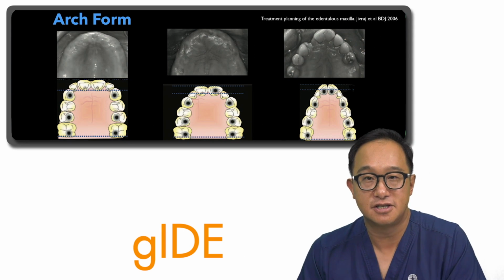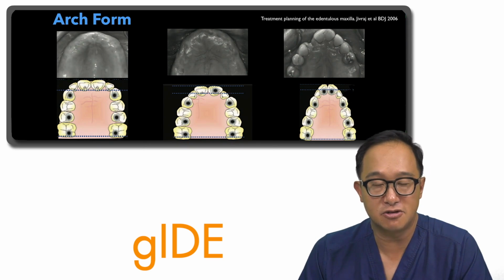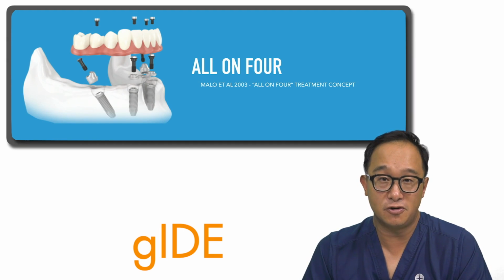So in 2006, Jivraj in the British Dental Journal looked at some of the treatment planning for the edentulous maxilla. And they looked particularly at the cantilever forces if you place your implants in differing arch forms. So here you can see a square arch form compared to a V-shaped arch form. In the V-shaped arch form, if you don't have implants anteriorly, then you would have much larger cantilever forces applied to a prosthesis. So when thinking about numbers of implants, sometimes you have to add implants and not use the minimum number, because you might have cases like this one that has increased forces because of the cantilever of the prosthesis.